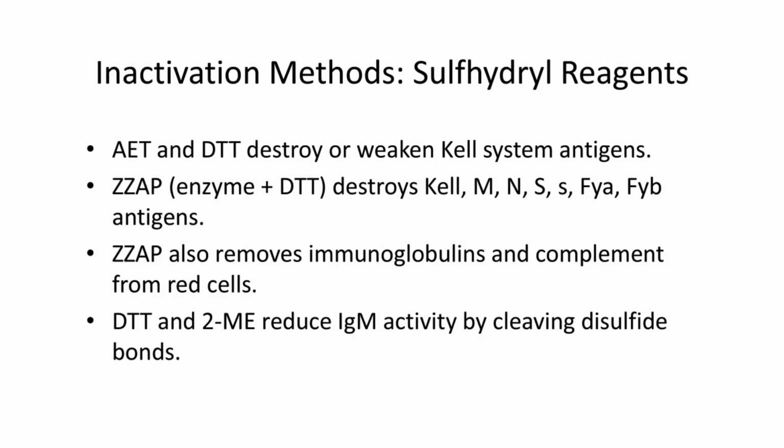Inactivation methods. Inactivation techniques are used to modify or destroy specific antigens or antibodies, enhancing the accuracy of antibody identification. First, sulfhydryl reagents such as AET, 2-aminoethylisothiouronium bromide, and DTT, dithiothreitol, are used to destroy or weaken KEL system antigens.